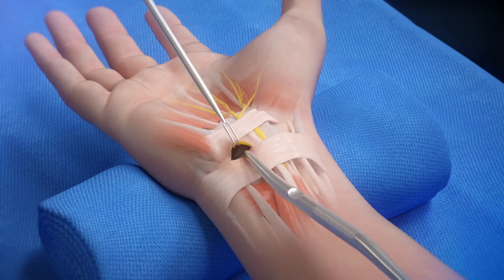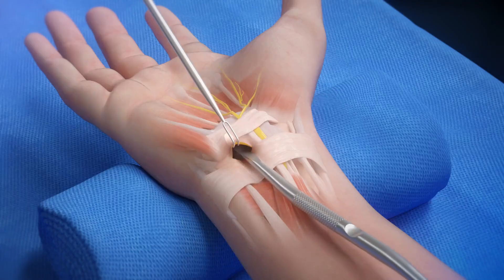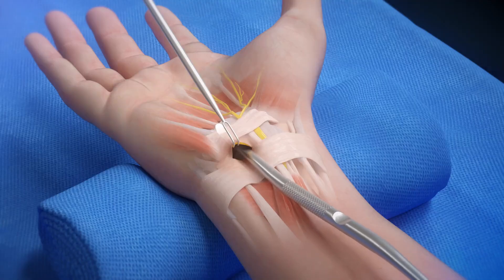Remove the dilator and use the synovial scraper portion of the double-ended instrument to clear the underside of the transverse carpal ligament. A washboard-like effect should be felt as the instrument is moved back and forth.